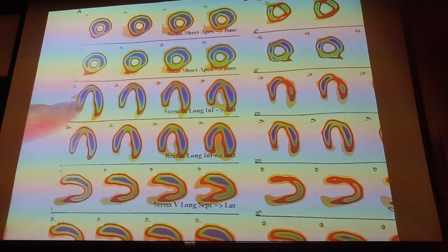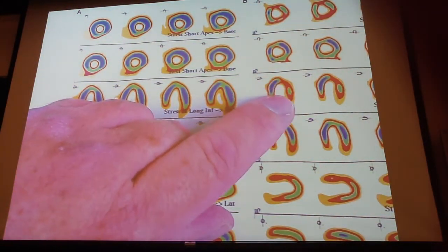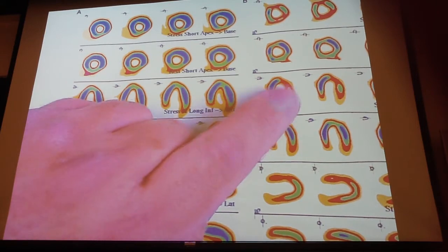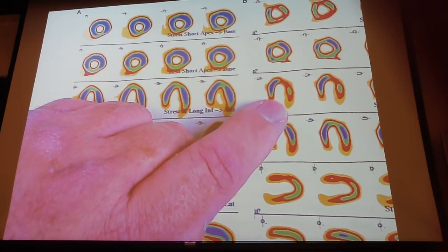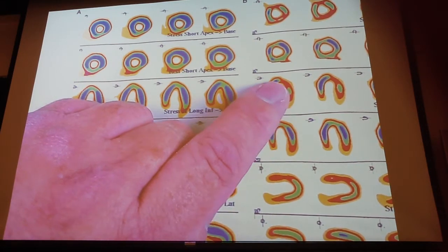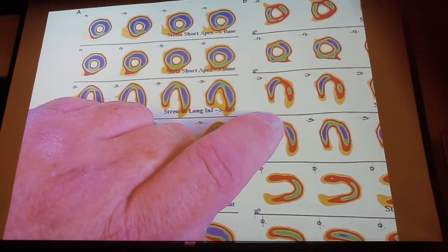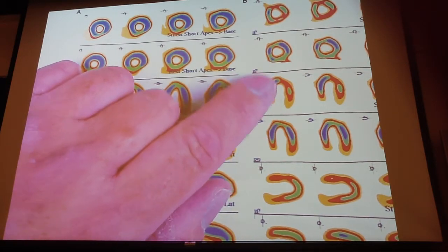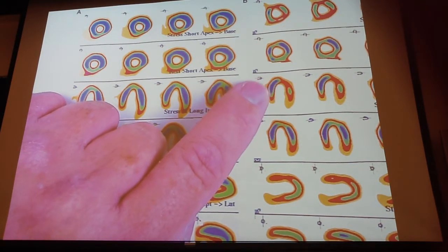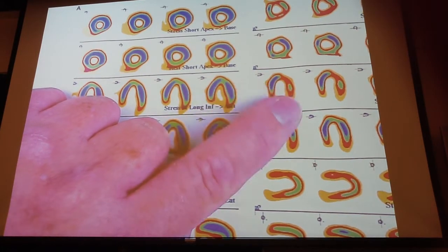Some doctors like it presented in that manner, because they're saying, we have 100% here. What part of the heart is this? This is the lateral wall. We've got maybe 100% in this part, 80% where the yellow is, then green, which might be 60. And over here the blue color, which is probably really bad. It's telling you that the septum and the apex are not getting perfused at all compared to the rest of the heart.